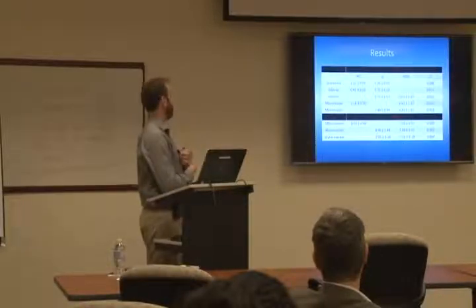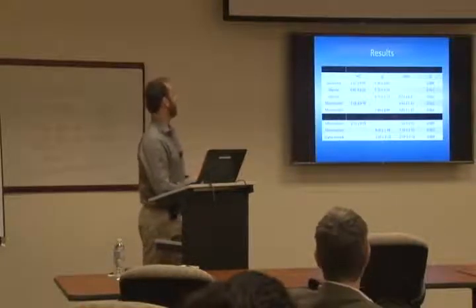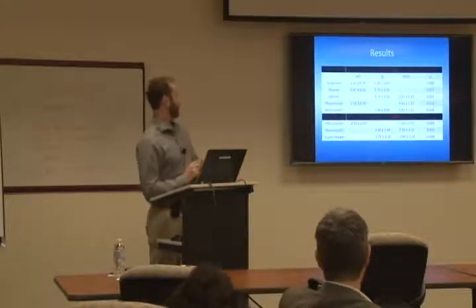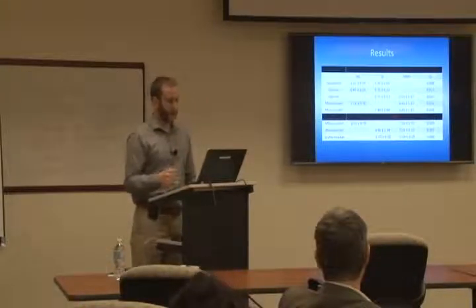And then the other big result that I thought was really interesting was we saw significantly increased glutamine in schizophrenia relative to the healthy controls, and significantly decreased glycine in schizophrenia relative to the healthy controls and the major depressive disorder group.